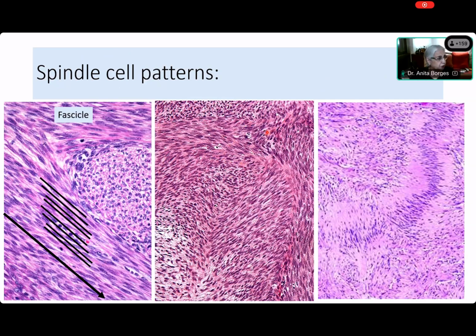angle. Right. So Diksha, you can ask for an annotation, and please show everybody where this herringbone spine is. Have you asked for an annotation? Yes, ma'am, I've received it. Okay, come on, show me.